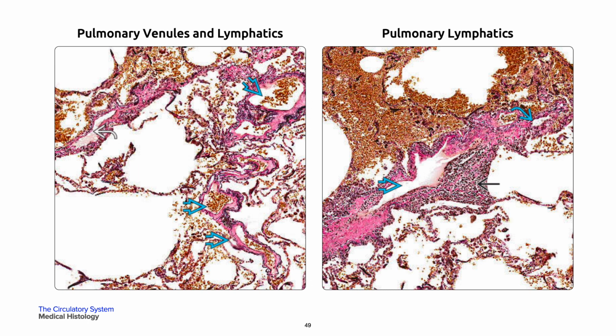On your right is a lymphatic channel in a bold blue arrow showing a complex luminal branching and some associated extranodal lymphoid tissue in a single black arrow. A small vein in a curved blue arrow is also present for comparison.